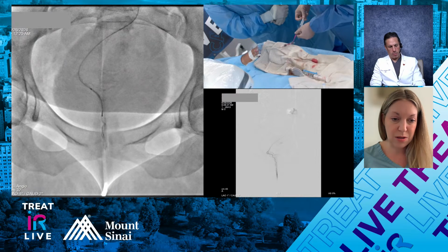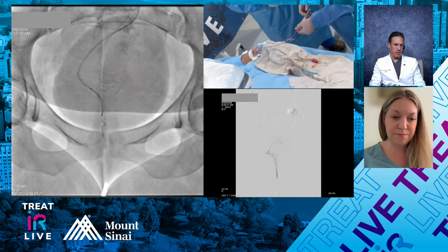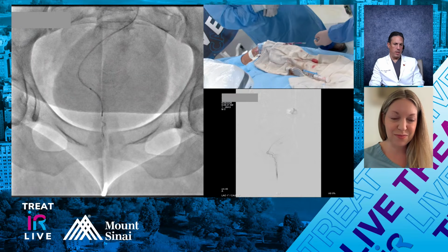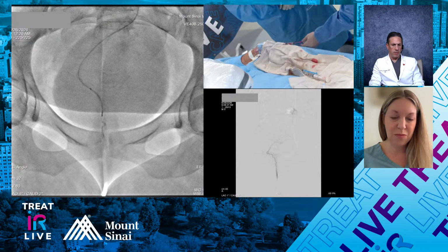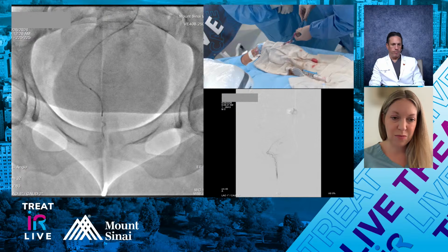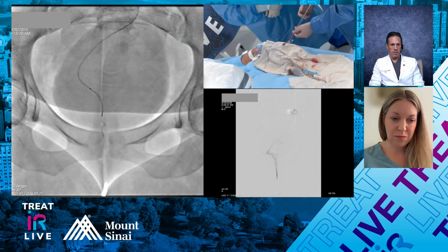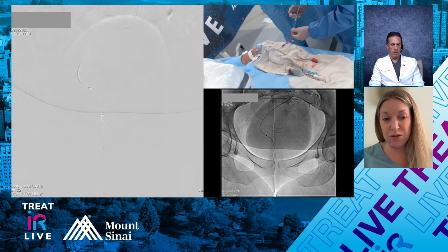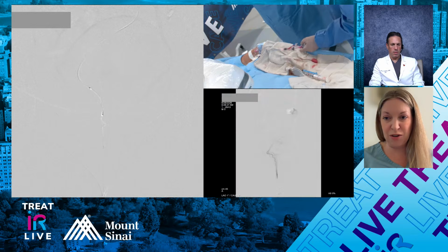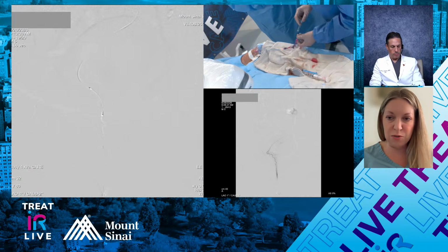Yeah, a little chunky. That's a 2-4 Progreat, you said, right? Yeah. One of the things about this case as compared to maybe a knee or a prostate is that the microcatheter size doesn't have to be super small necessarily. You could see how distal you got this 2-4 pretty easily down to that spot. Are you ever using small catheters like 1.7, 1.9, or you don't think it's really necessary for cases like this? I have, but I feel like the 2.4 is great because you get really good imaging and you can push your particles easily. So that's what I tend to use.